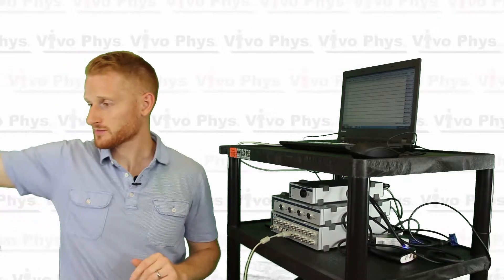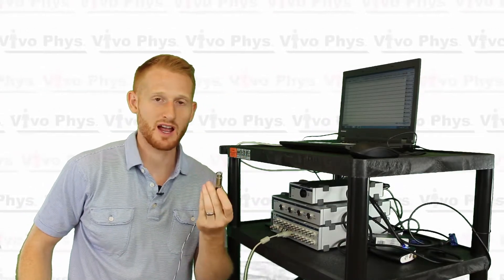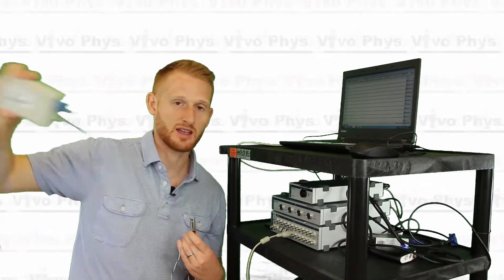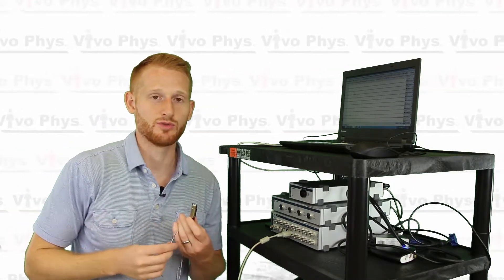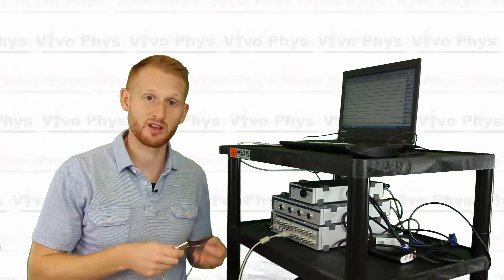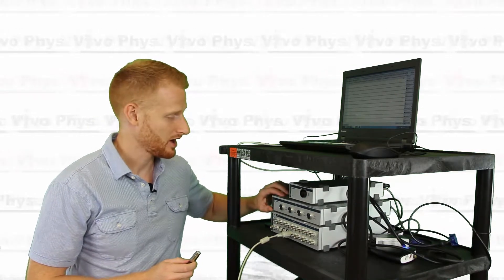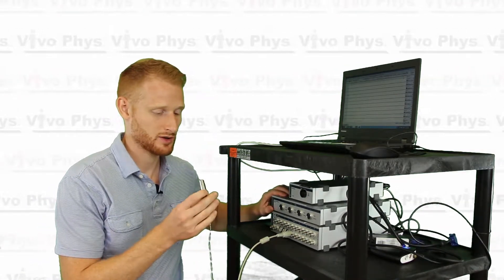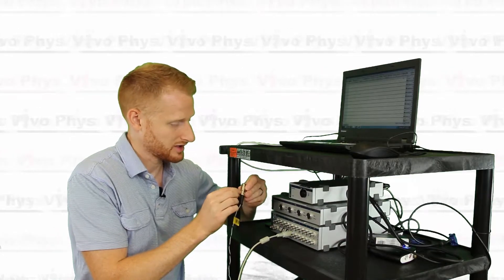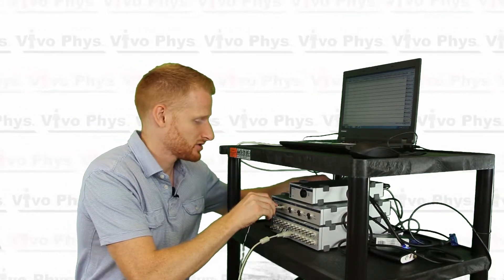The skin probes have DIN connectors as well, but they have to go through an extra amplifier. The rectal temperature probe went through the T-type probe amplifier; the skin probes go through a bridge amplifier — in our case, a quad bridge amplifier, meaning there are four different ports you can plug things into. This goes into the top box on the PowerLab, our quad bridge amp. Make sure you line up the pins correctly when plugging in — there's a little indicator on top of the cord — and push it in.